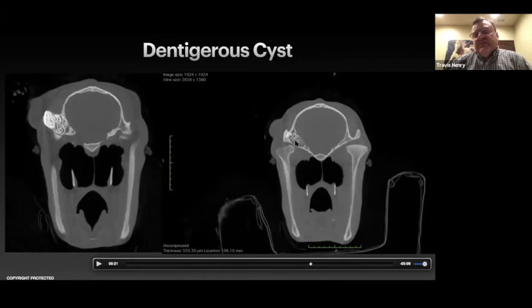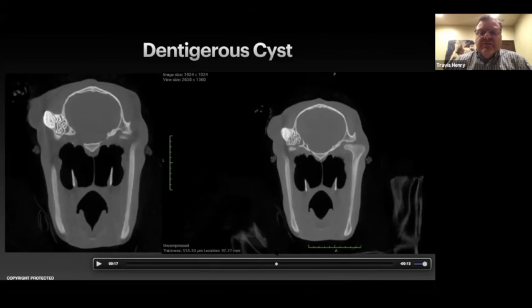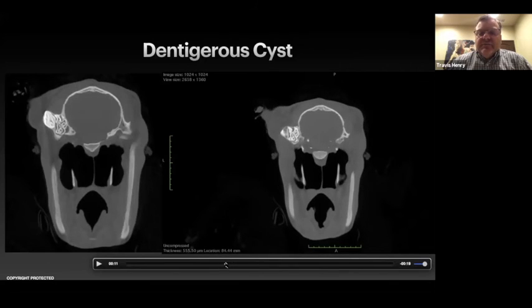What was interesting about this case, it was highly productive. There's a lot of fluid coming out the little fistula by the ear. You could milk that out, and 20 minutes later, you could milk another 20 to 30 mils out of it. We should have tested the fluid, but we did not. We were either getting CSF fluid coming out through there or joint fluid of some sort, because it was extremely productive. So we talked to the client about the risks of going in and removing this, potential for seizuring and issues with the brain, and also having the temporomandibular joint in so close approximation with this, and the client opted for euthanasia.